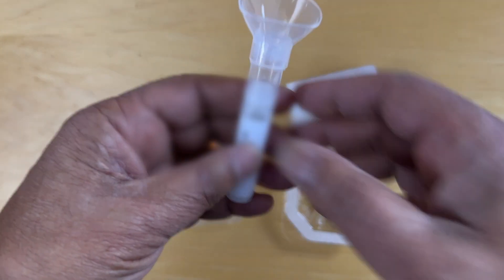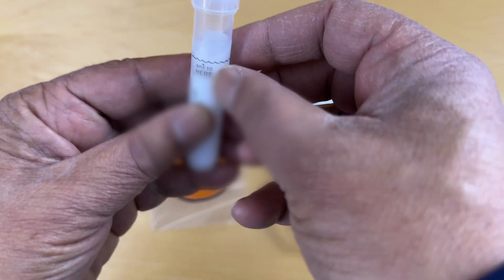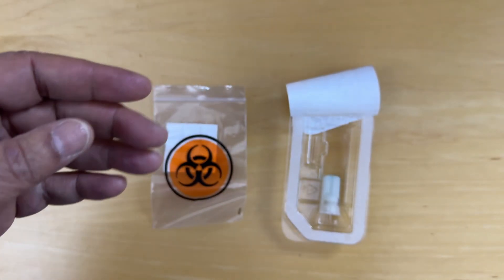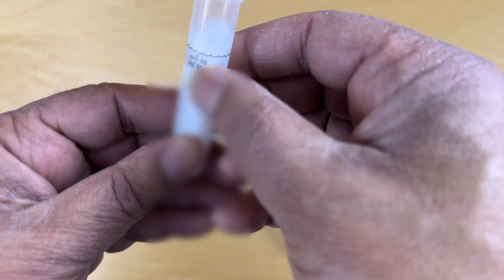Okay, now we've got this filled to about there. It says up to there without the bubbles, so I'm just checking that to make sure. Yep, so up to that point — and the bubbles are above that line.